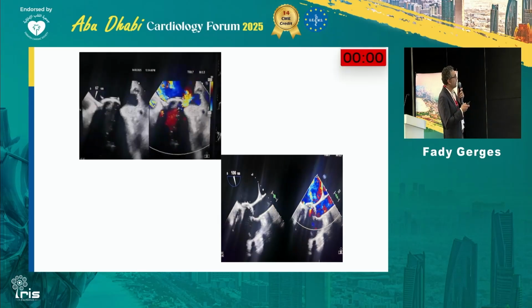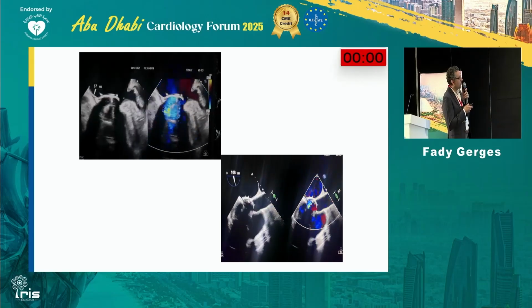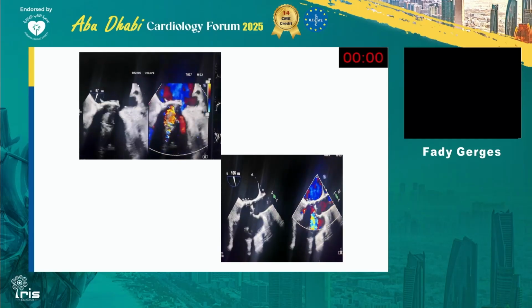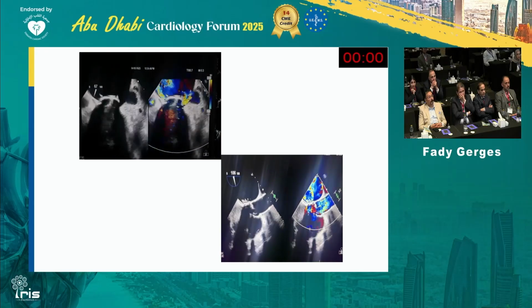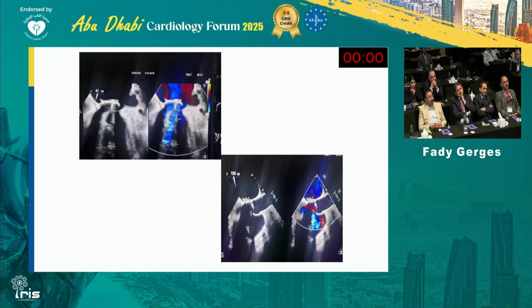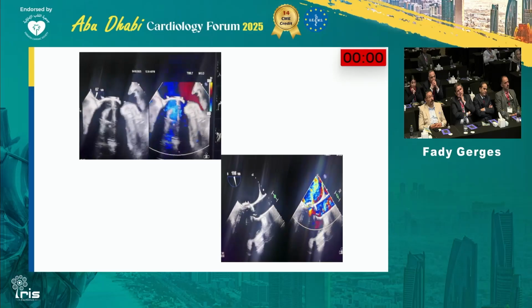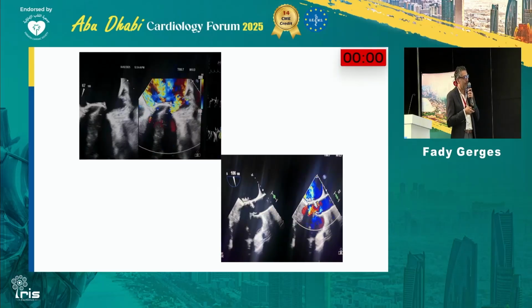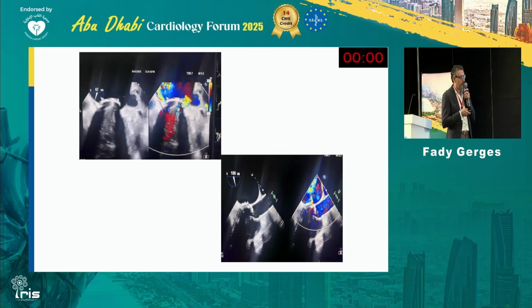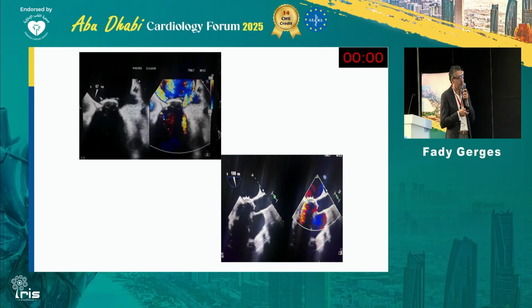So as you can see here, this is the mechanical valve, and there is a gap here, which we said many times about in other examples, that this is a dehiscence. And you can see that there is a severe mitral regurg going from around, periannular, around the valve. It's not coming from the valve itself. So that means the valve was okay. There is no valvular regurg. It's all paravalvular. Again, another view, 3 chambers view with the aorta here in face. You can see the struts and the ring, and you can see that there is significant mitral regurg.